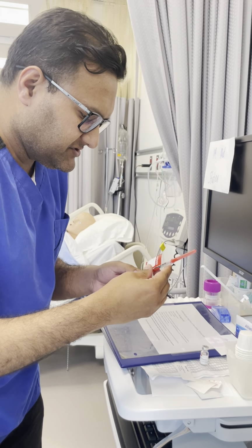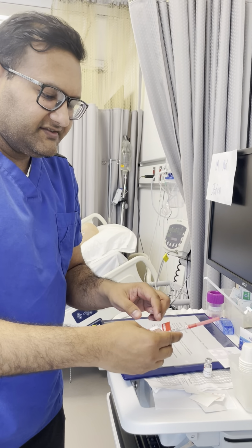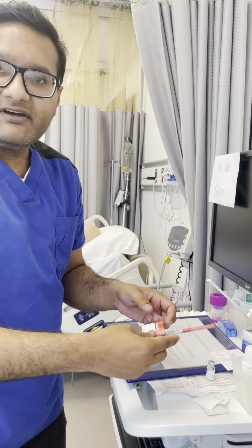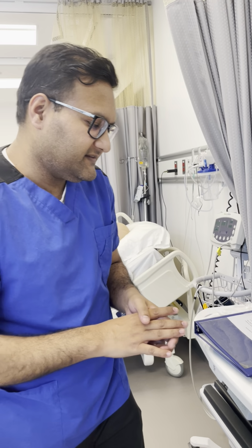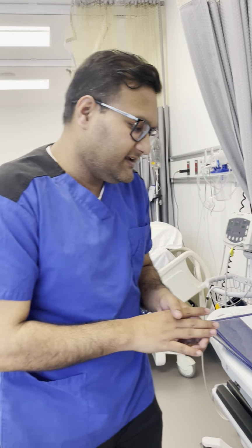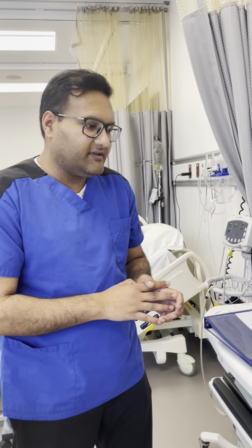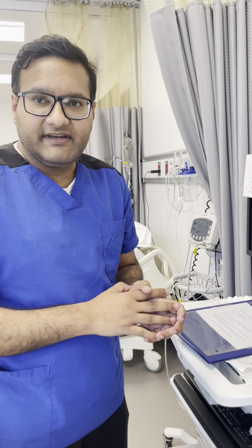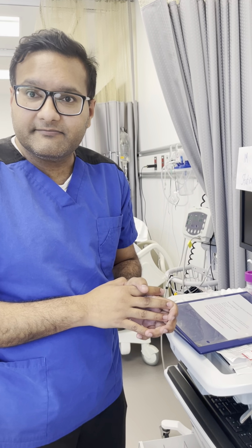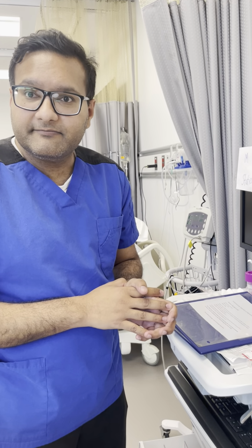And again, I'm going to ensure that it is visible, that it's drawn out at 0.6 ml with the vial out and my patient label. And because it is a controlled substance, I'm now going to have a second check with my nurse to ensure that this is the right dose. And so I'm going to have my nurse independently check this with the patient order. And once confirmed, I will then proceed ahead with the patient. So you need to put that out so that Carla can do that independent double check for you.